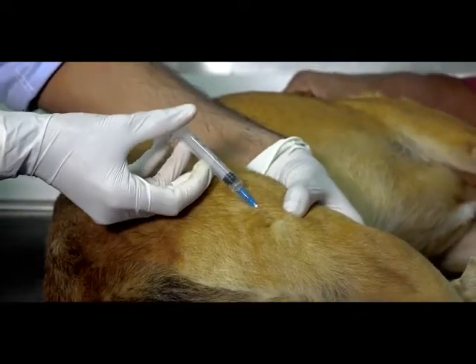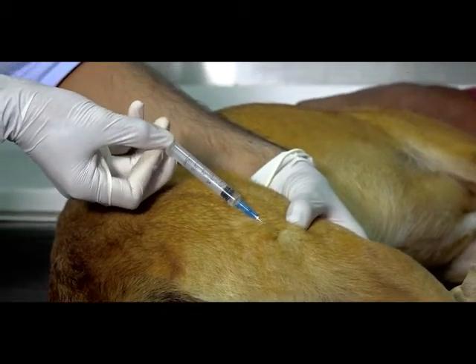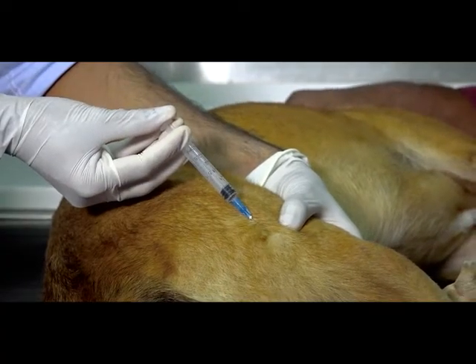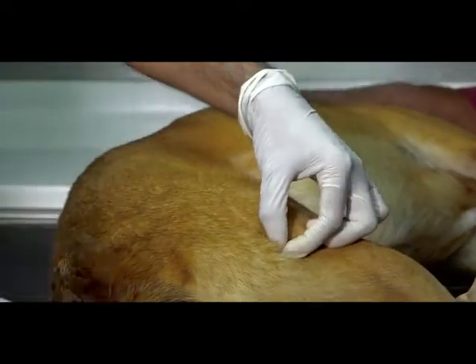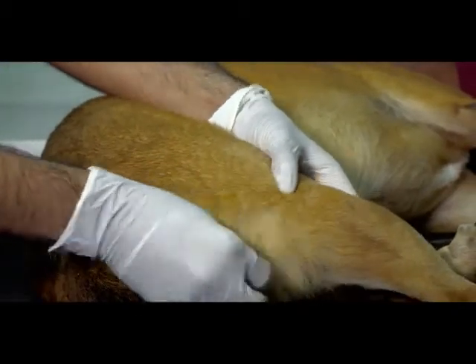A bit of a reaction from Harmina. You gently pull the plunger back to see if there's any blood, and then slowly administer the drug. Cotton, place it here. Please withdraw the needle and give a gentle rub on it so the drug is properly distributed.